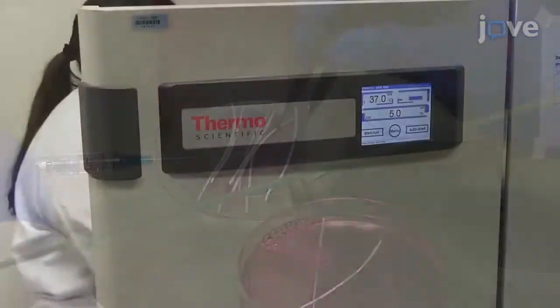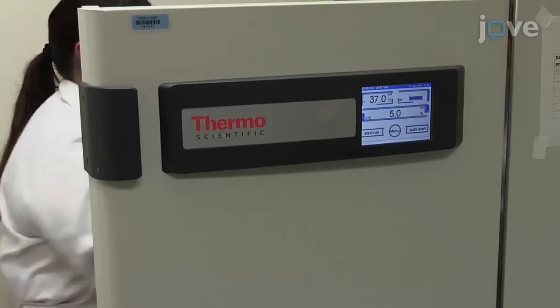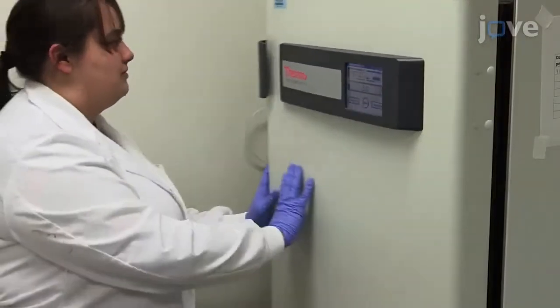Place 6 seeded fibers into a 6-centimeter diameter petri dish, and briefly incubate the seeded fibers at 37 degrees Celsius and 5% carbon dioxide.